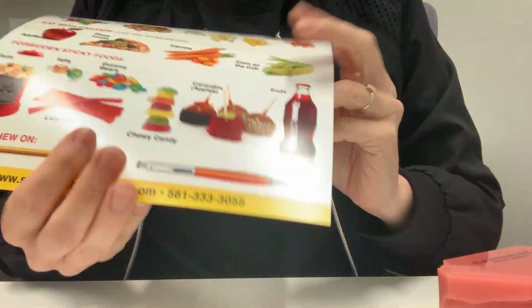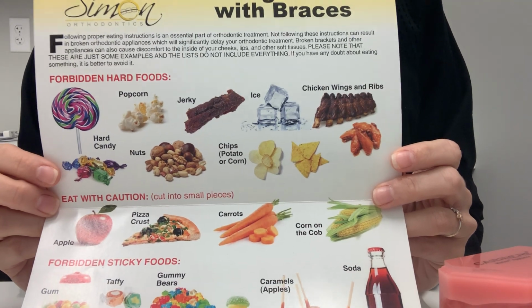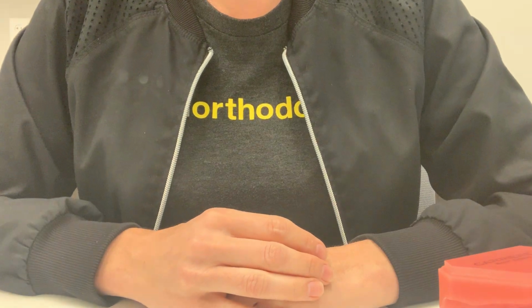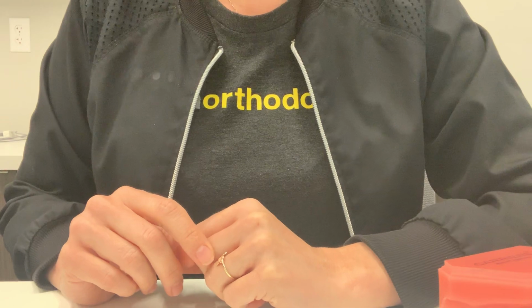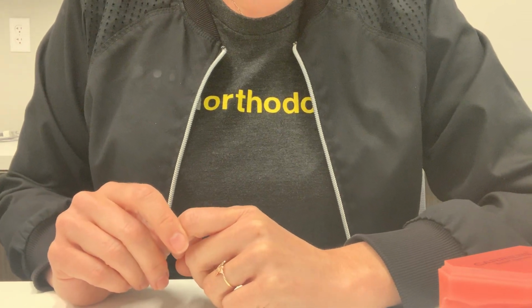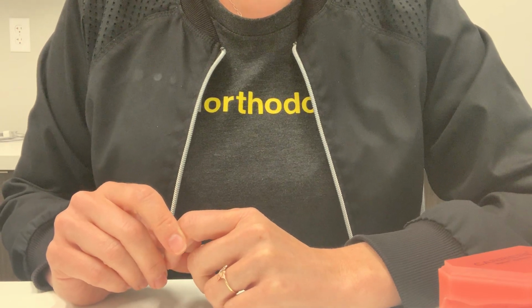You're going to receive a card that looks like this. It reviews the foods that you need to avoid eating. You're going to avoid anything sticky, chewy, or hard or crunchy. If something does ever break, you always want to save the piece. Give us a call to let us know so we can schedule an appointment for you, and save the piece and bring it in with you when you come in for your appointment.